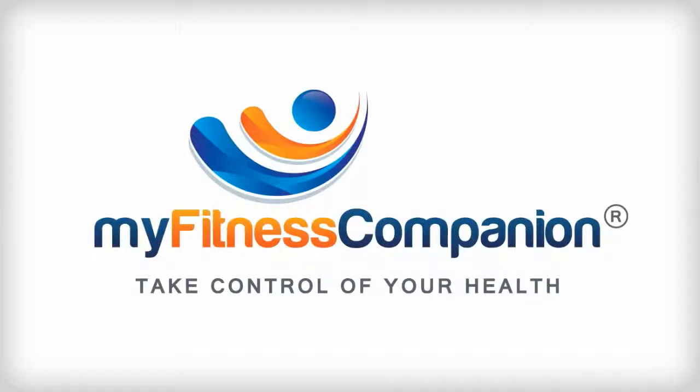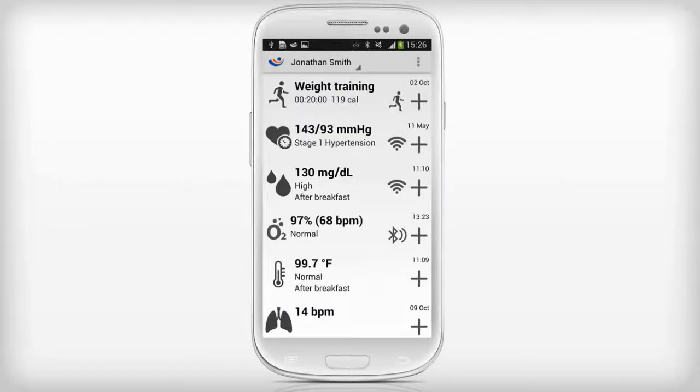How to configure the Fora D15 Blood Pressure and Blood Glucose Monitor with MyFitness Companion. Click on the list menu to start configuring the Fora D15 device.